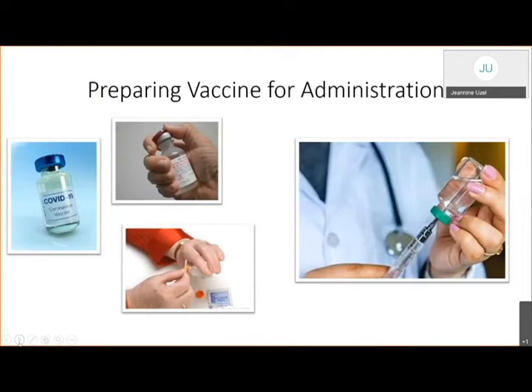The cap on top of a vaccine vial functions as a dust cover. Once removed, cleansing the exposed rubber stopper with a prepackaged sterile alcohol wipe is recommended. Do not enter a vial with a used syringe or needle. Standard medication preparation guidelines should be followed for drawing a dose of vaccine into the syringe. A vaccine dose should not be drawn into the syringe until it is to be administered.